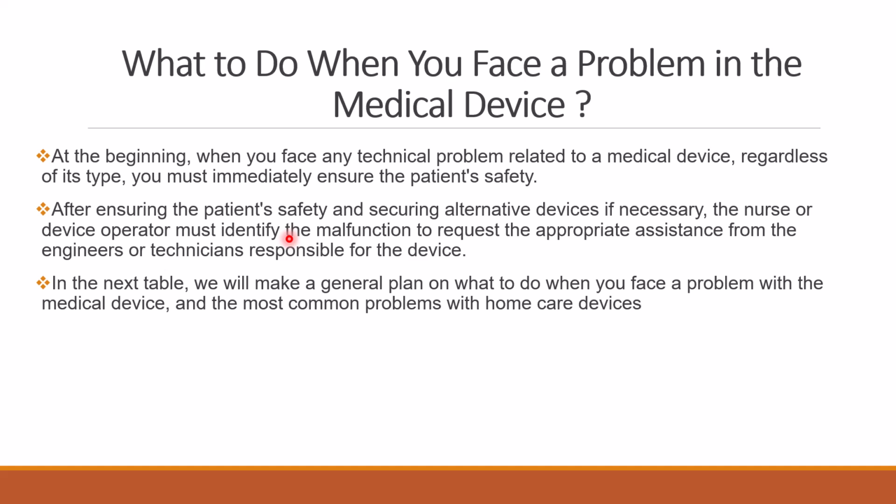After we have a broken device, a device with a technical problem, we have to ensure the patient's safety first, and if needed we are going to replace the device and support the patient with a new device or an alternative device.